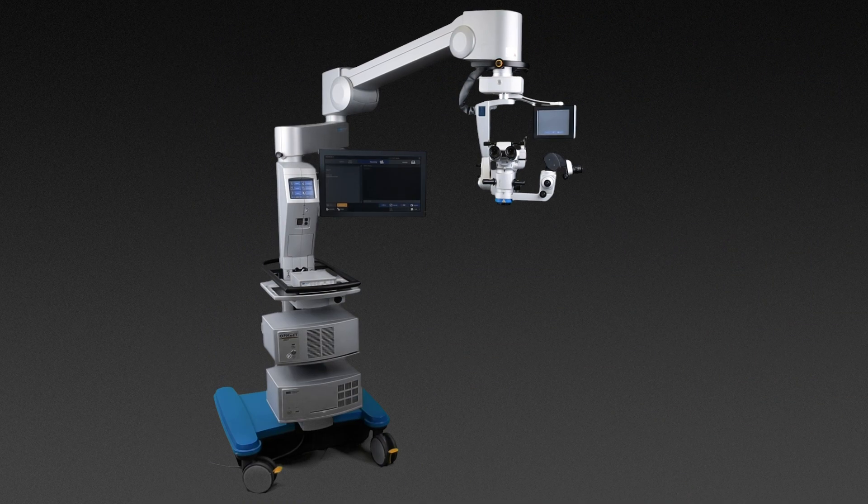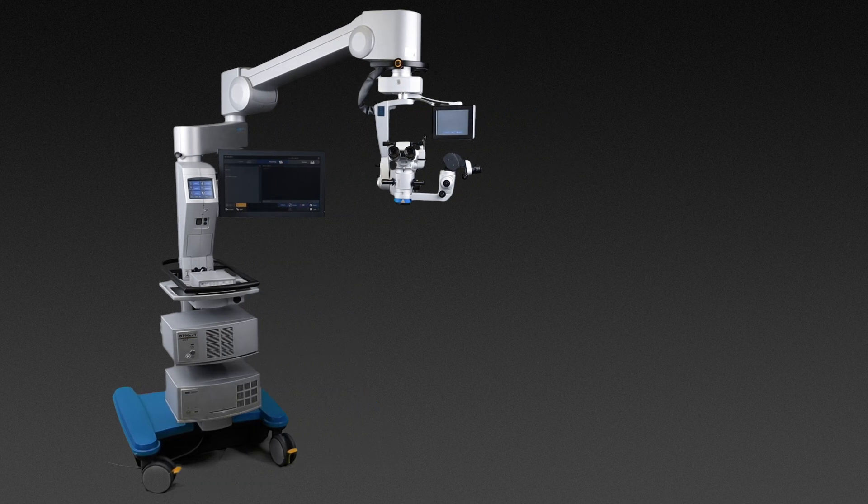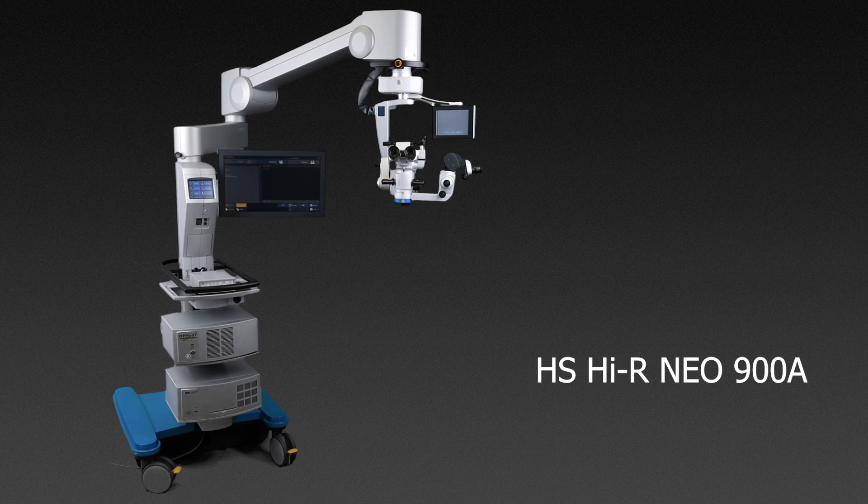Performing several surgeries a day requires a microscope with excellent visualization. Choose the HS-HIR Nio 900A and experience crisp optics and exceptional ergonomics.